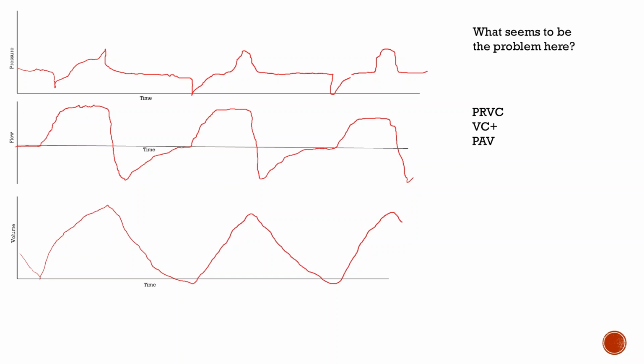And a lot of times we go to the bedside and we see the peak pressure is 13. We're like, yes, we are doing great with our ARDS. The peak pressure is 13. But it's really 13 because the patient's taking the whole breath. So it's the patient's negative pressure contributing to the decrease, and the plateau might actually be 30, but the patient's not sedated and paralyzed, so you shouldn't be interpreting that 13 peak as a true peak. Okay. So it's kind of like a flow starvation of a PRVC mode of ventilation.